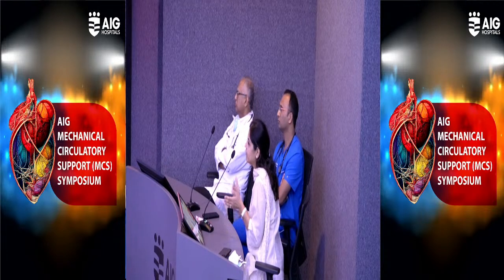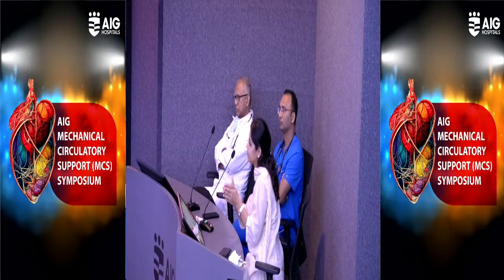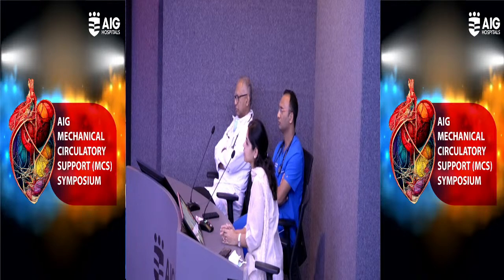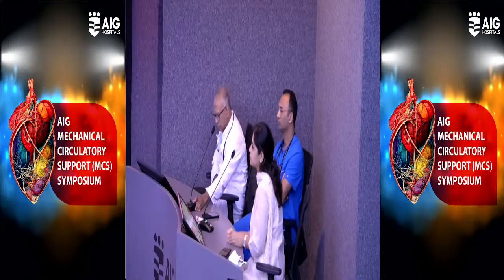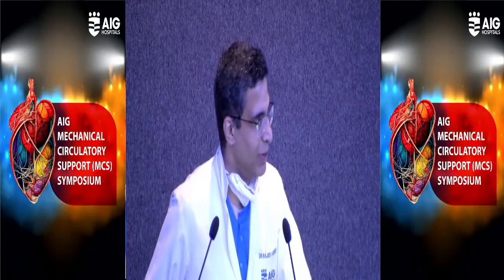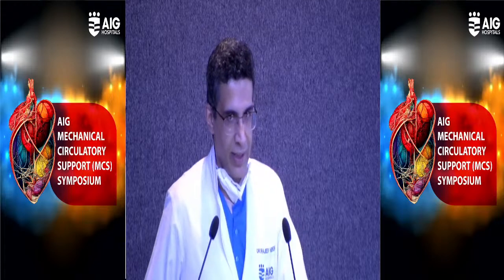But I always feel, should we revascularize first, or should we just get all this information and then decide whether to revascularize or just establish perfusion? Yeah, actually, almost every 3 days in the morning report, there is a discussion about this. 50% say we should have revascularized first, and 50% say we should have put IABP first. But it's a difficult thing to answer.